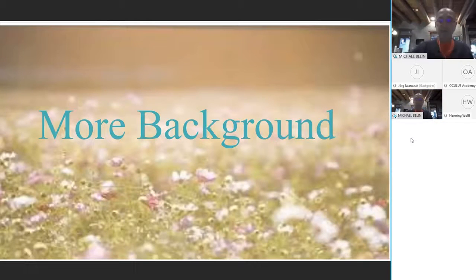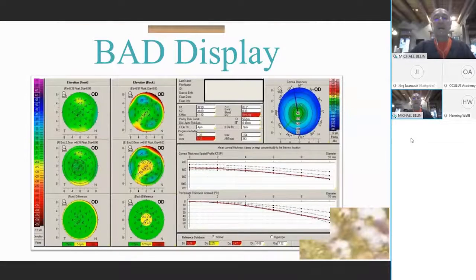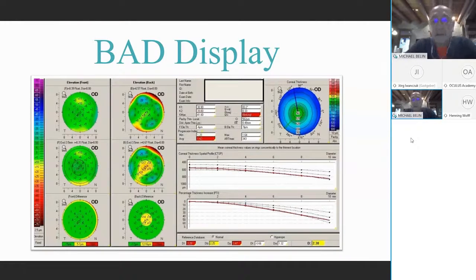So we're now going to go into some more background. And here we're going to talk a little bit about the BAD display. And the BAD display, many of you are familiar with it. I believe at this point, it's probably the most commonly used refractive screening display. It again utilizes 9 different parameters in a regression analysis. It gives you an overall reading, which is a separation from normal. And I think that's very important. The BAD display is a refractive screening display. It's designed to separate normal from abnormal.